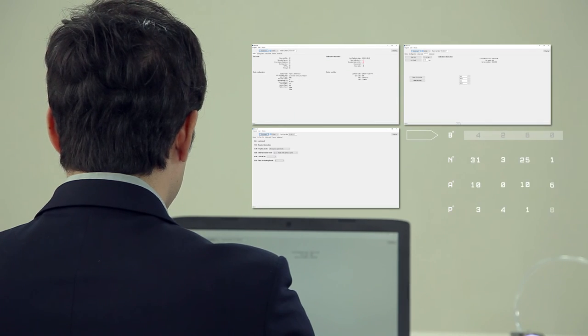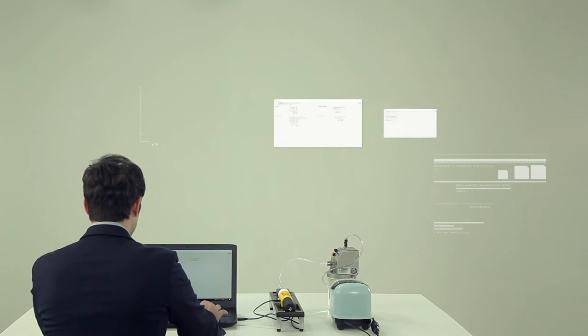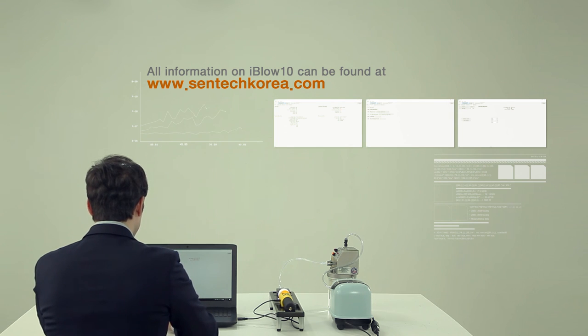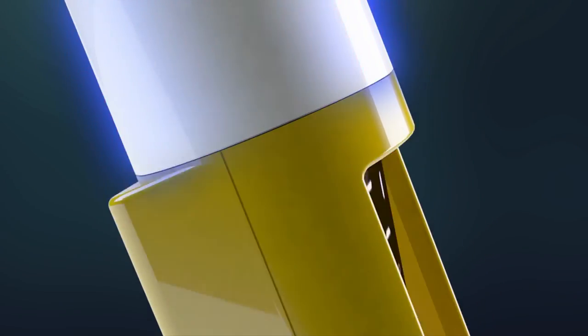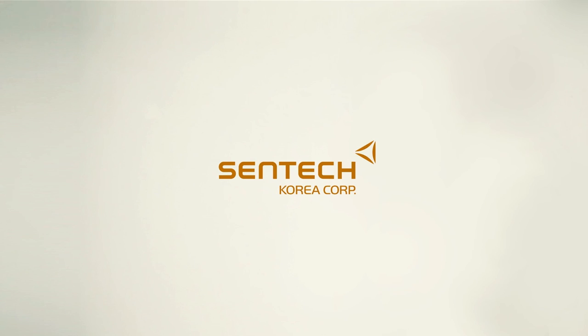For more detailed instructions for iBlow 10, please refer to the instruction manual enclosed within. All information on iBlow 10 can be found at www.centechkorea.com. iBlow 10 — a fast and easy way to conduct sobriety tests. iBlow 10 is a new and upgraded premium breathalyzer. Centech Korea.